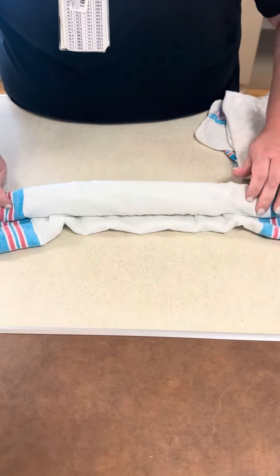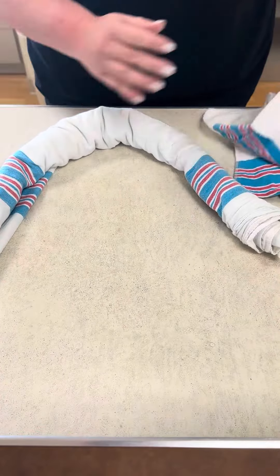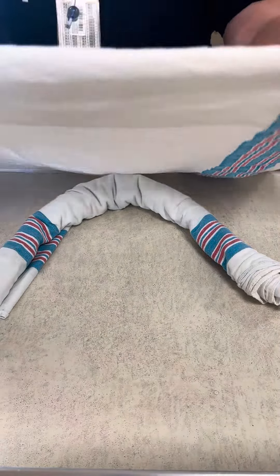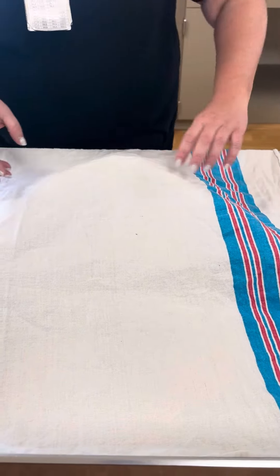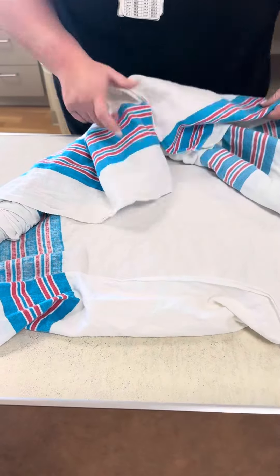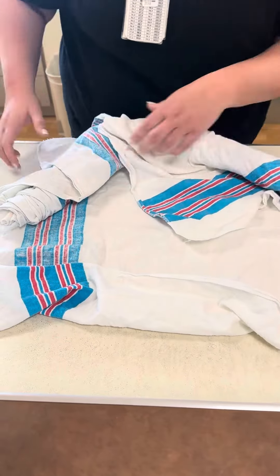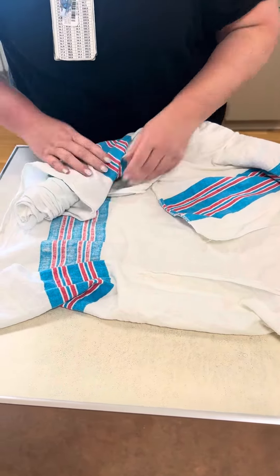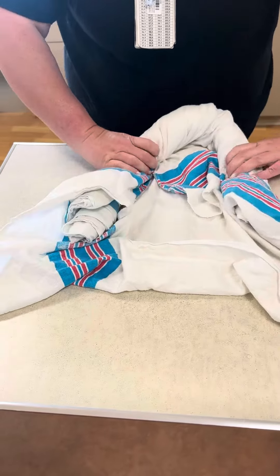Then we take that and sort of make it into a U-shape. You're then going to take your additional blanket, open it up all the way, and lay it over your U-shape. I take the whole entire thing and flip it upside down, take these edges and wrap them into the roll, folding it into your roll. Then you can roll the whole thing again so that it's nice and tight.